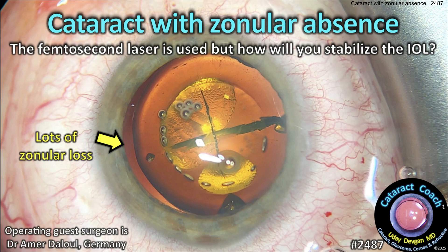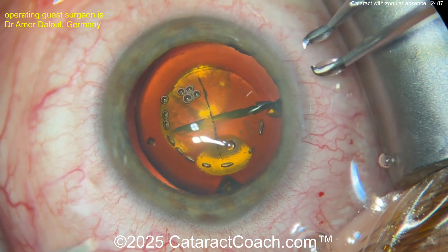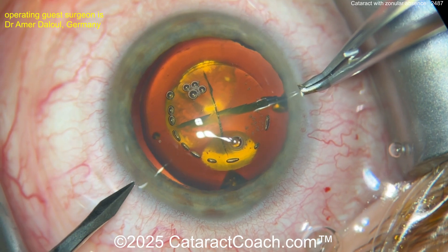Cataractcoach.com — cataract with zonular absence where the femtosecond laser is used. How will you stabilize the IOL? Let's watch this fun case. There's a femtosecond laser that is helpful in creating the capsulotomy in a case like this where there's so much zonulopathy.